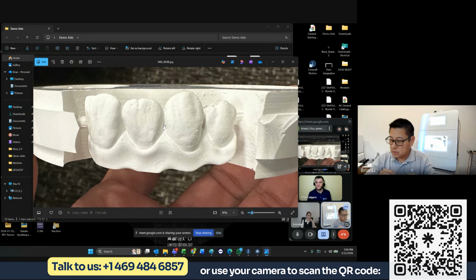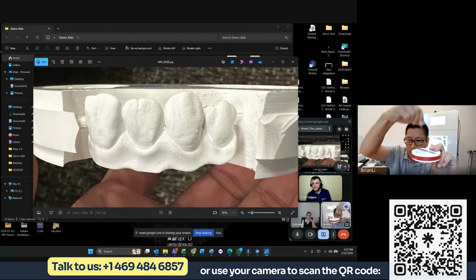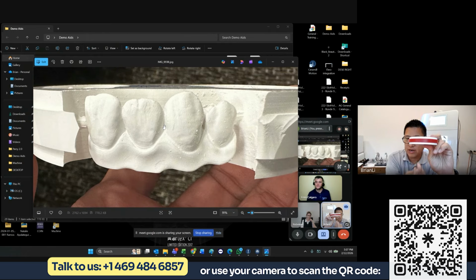If you're milling a puck normally like this, you are normally milling from this direction and not this direction. Obviously, because the holder is there, you would be going through the arm, and the C-clamp opens up this way, which allows the mill to now come in at this angle.